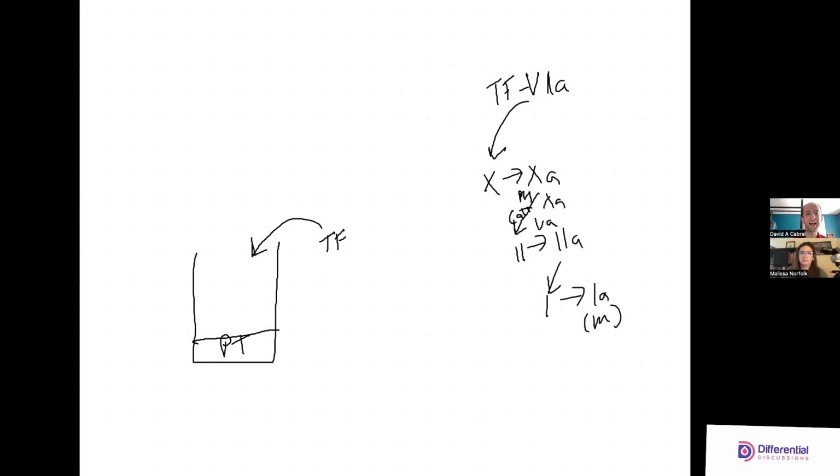So one thing we can see when you draw this out is that there are fewer intermediate steps. As a consequence of there being fewer steps, and just the way the reactions go, PTs tend to be shorter than the APTT in time. But very similar, as soon as the PT reagent hits the cuvette, that calcium, phospholipid, and tissue factor is going to immediately go to work. That is when the analyzer will start its internal clock.